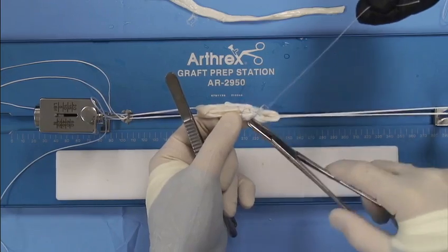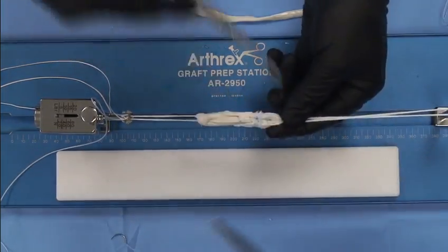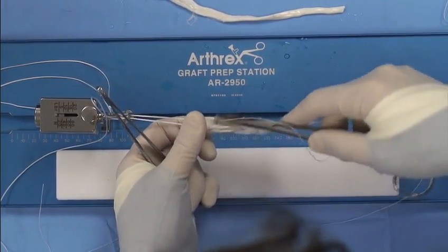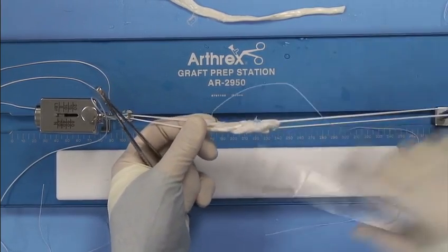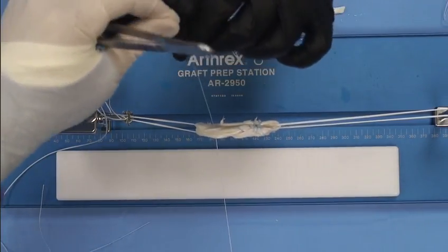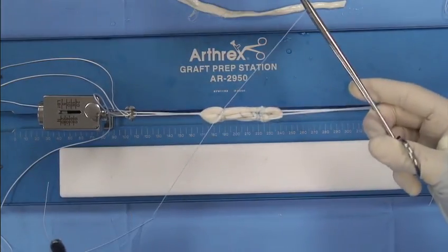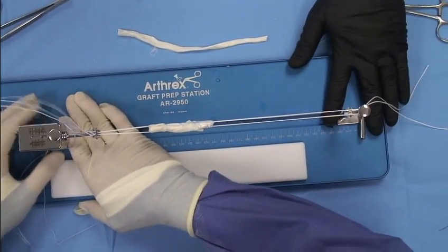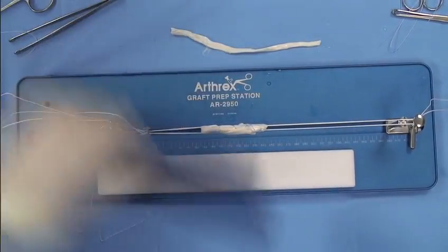We'll get these nice and even. And then on the femoral side, we're going to go ahead and use a buried knot technique. We're going to start in the middle, strand number two, three, four. Wrap it around 360 degrees and come back through strand number one. And now we'll go ahead and tie this. You could put a second one of these on the femoral side; for the purposes of time we're going to stop right there. You can see that it's under 20 pounds.